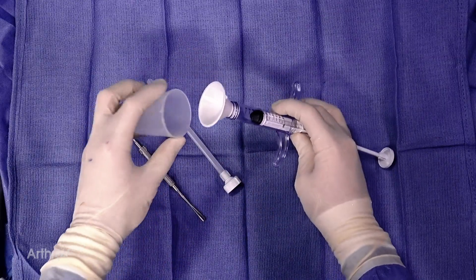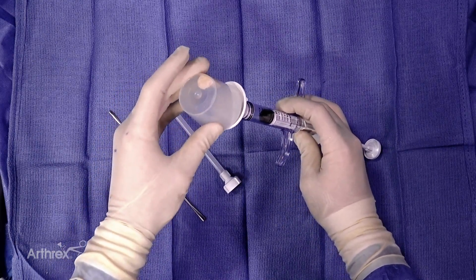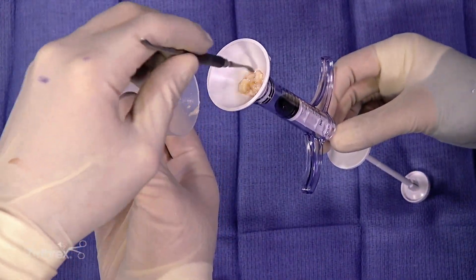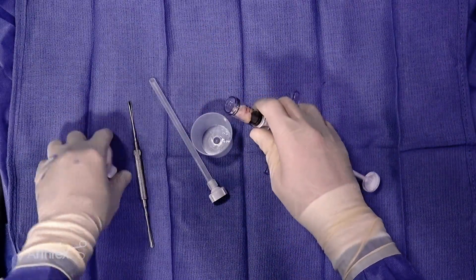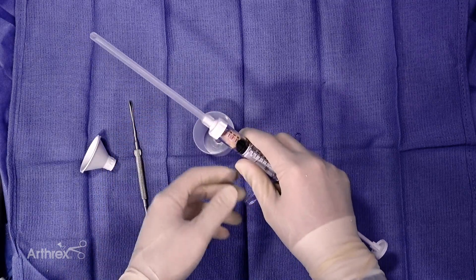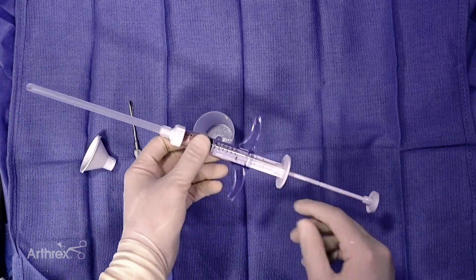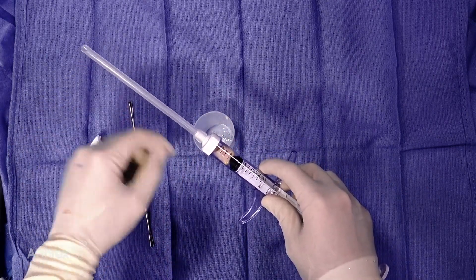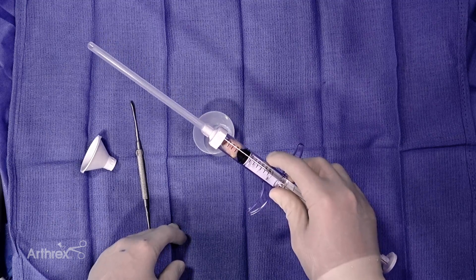What we can do is add this into our funnel. Because it's so adherent, sometimes I may need a freer elevator to help get this in there. Once I load that tissue, I can disconnect the funnel and then apply our delivery device. This looks like a long tube, and you may think we might lose some bursal tissue — but there's actually a second plunger that goes through here to help deliver that tissue all the way down to the tip. This can be inserted through a cannula to help deliver the bursal tissue where you want it.